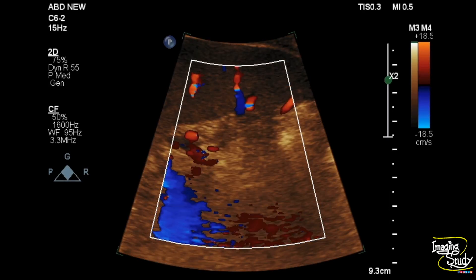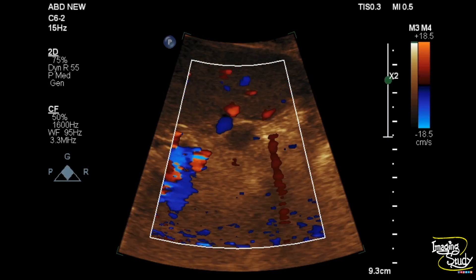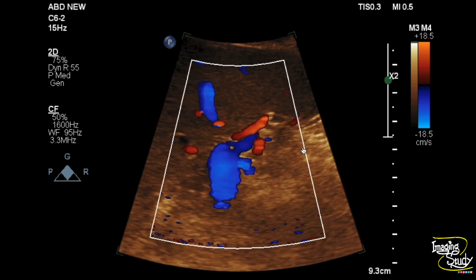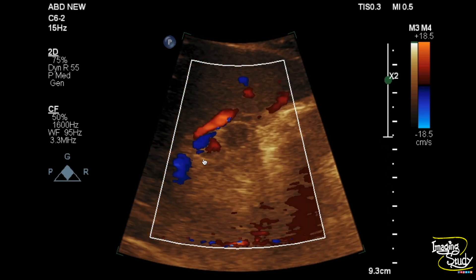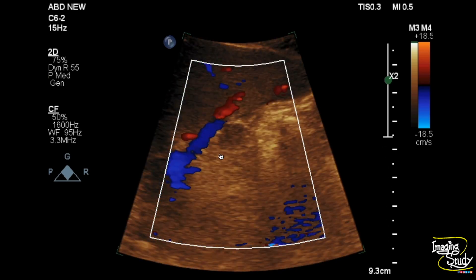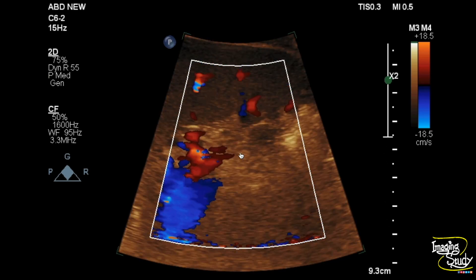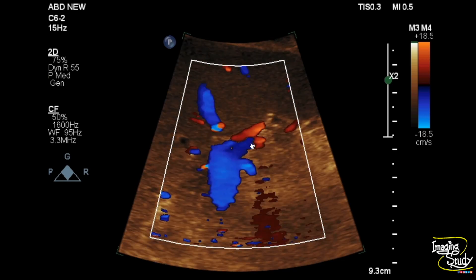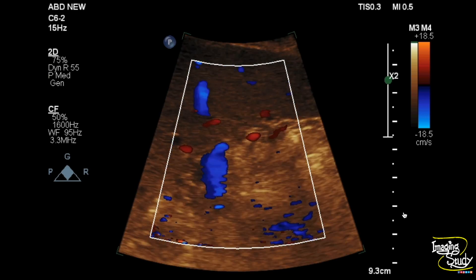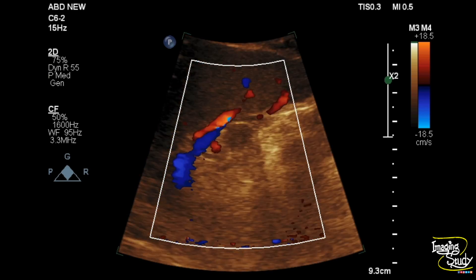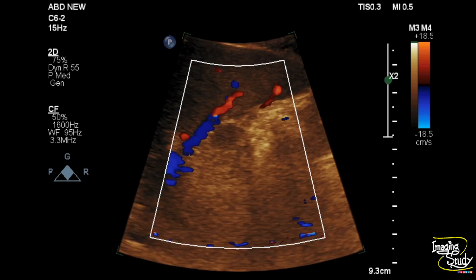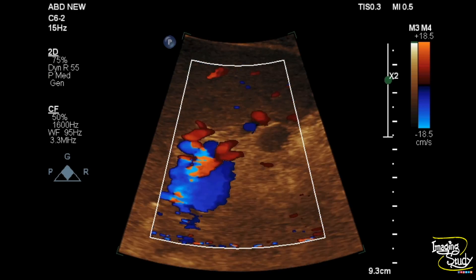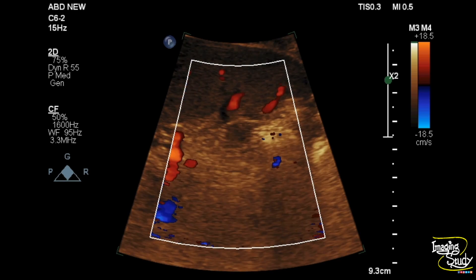If you apply color Doppler, you can see very tiny blood vessels supplying the structure, and these vessels are originating from the adjacent splenic hilar vessels. So this structure is the splenunculus or accessory spleen.